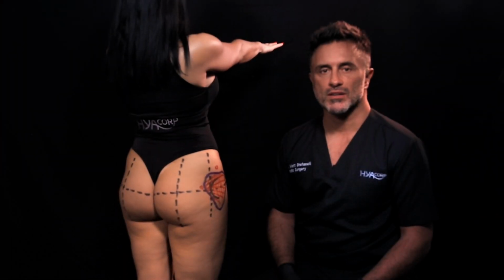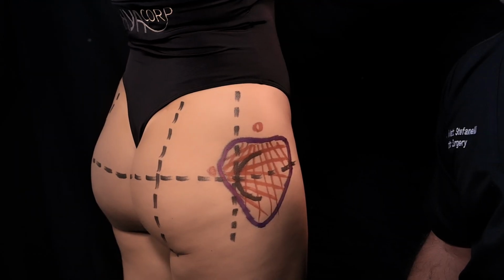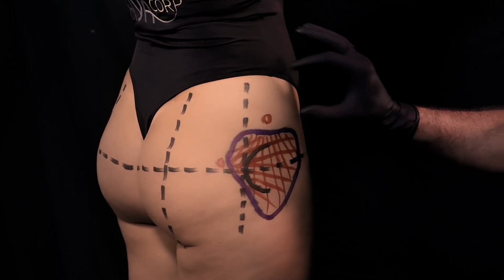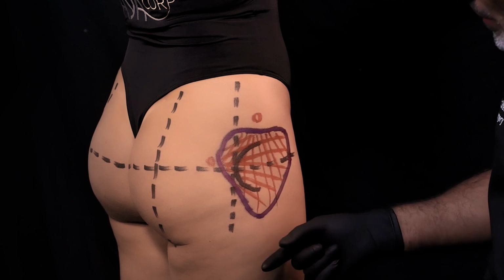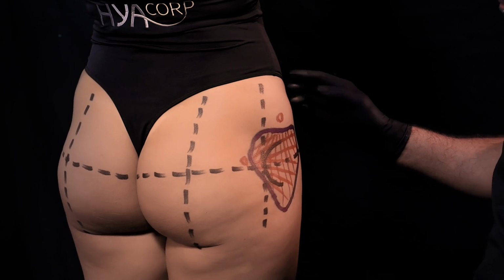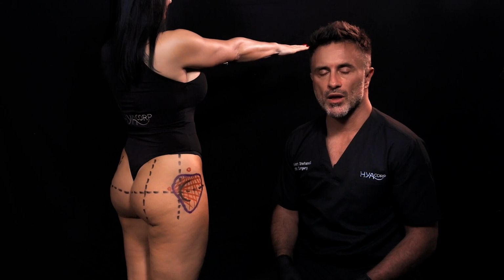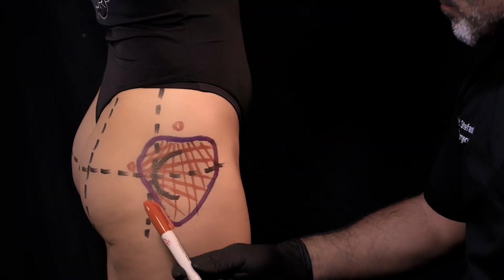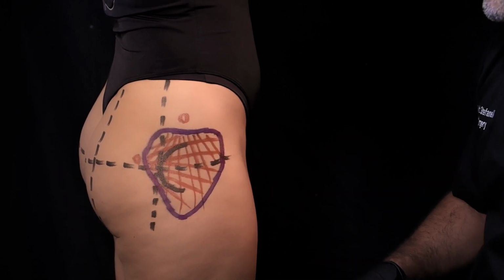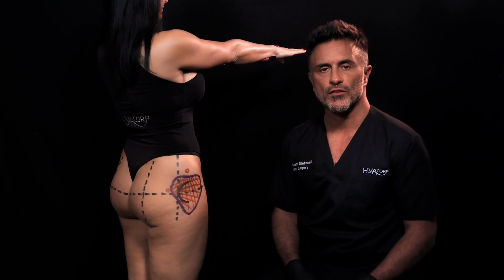We just finished the markings on the second side, and you can appreciate that they are not exactly the same. It's very common because the hip dips are very often asymmetrical. But the concepts are the same. We have here the upper hip, here the lower hip, and in between this depression that you can appreciate more in the back view. From this point to this point, there is this depression. And regarding the entry point, we will use again two, one medial for horizontal thread and one upper for more vertical thread, and we are able to cross our injection. So we are ready for the procedure.